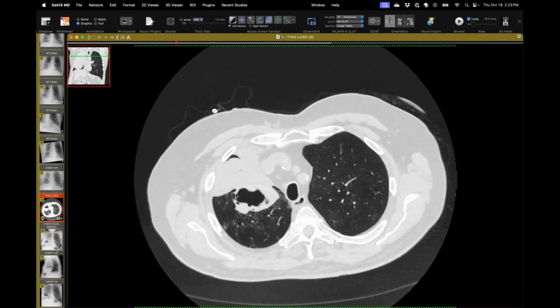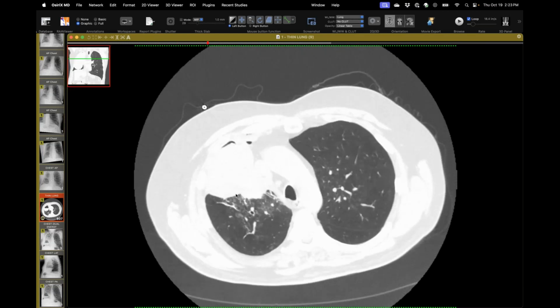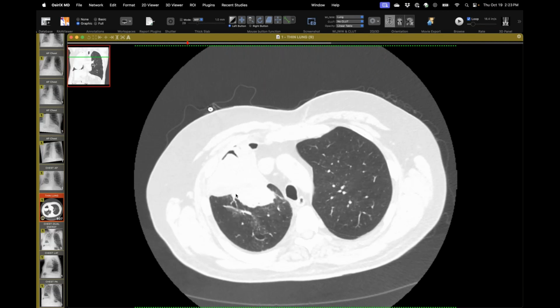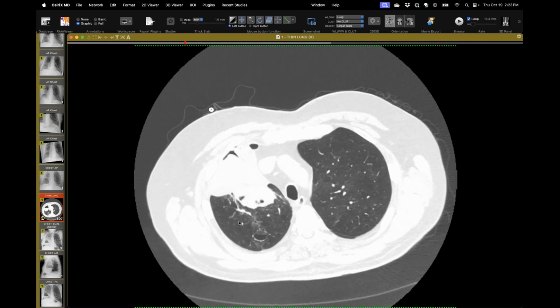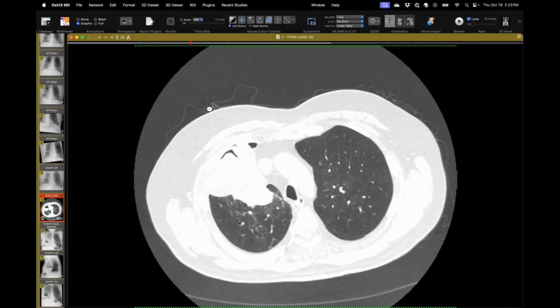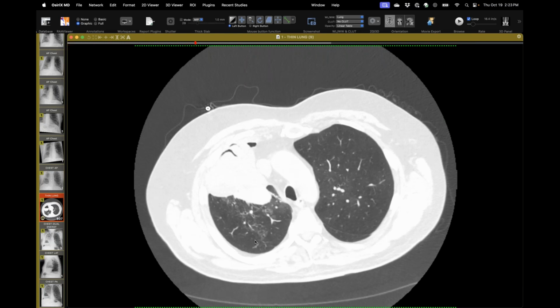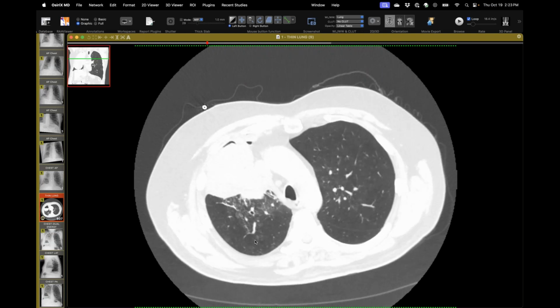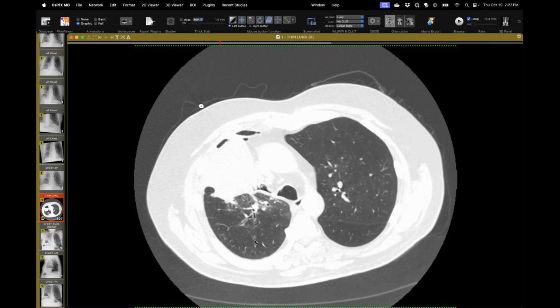The valves did their job, but we'd not seen these pneumatoceles before, and Daniela did find a paper that reported them. It's not a known complication, and our pulmonologists had not seen it, but it's one of these weird complications. I can't figure out why you get a pneumatocele other than there's just a rapid shift in pressures, and it's sort of like an endobronchial trauma with the increased pressure doing that. I don't know if any of you have ever come across this before if you're doing these valves.